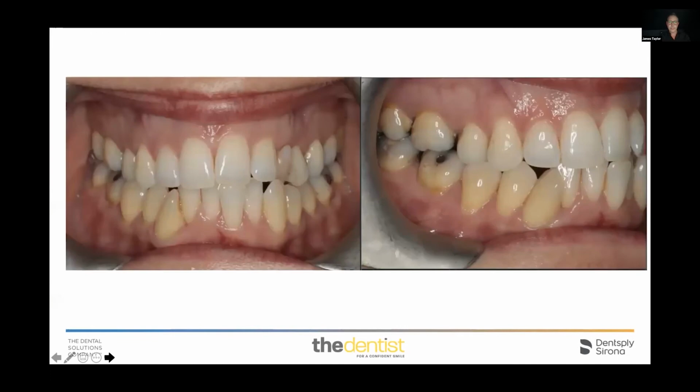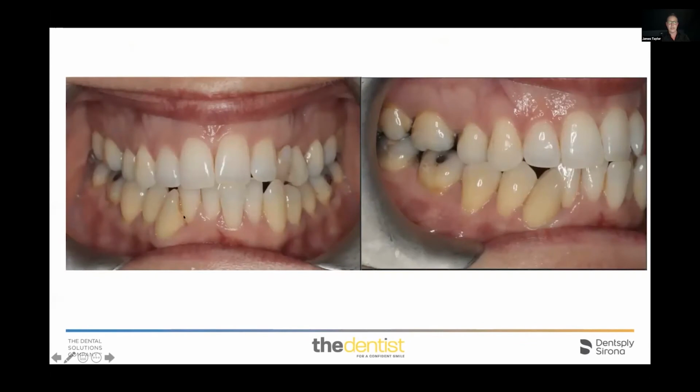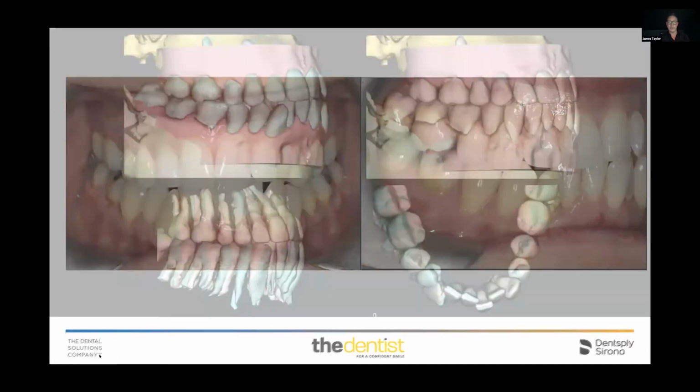Hybrid cases. So I'll use hybrid cases as well. I'll use fixed or lingual braces before I do aligner cases. So I'll go back actually. This is a case where the lower right 3 was very measly crowded out, as you can see, but had a nice tilt on it. So I knew that by removing the 4, I'll be able to tip that tooth back. But that was something that I wasn't confident doing using a liner. So therefore I used fixed to do that.